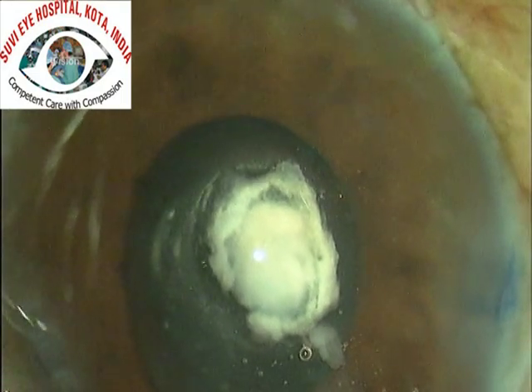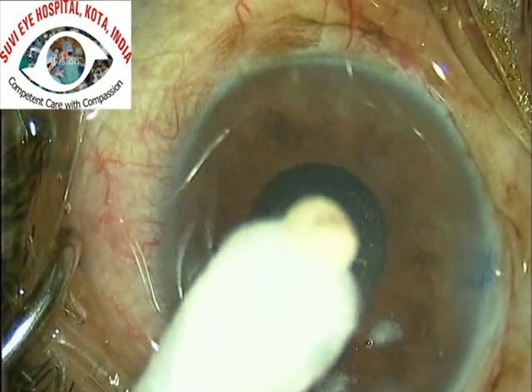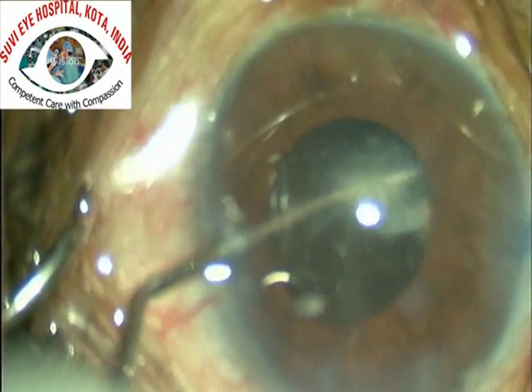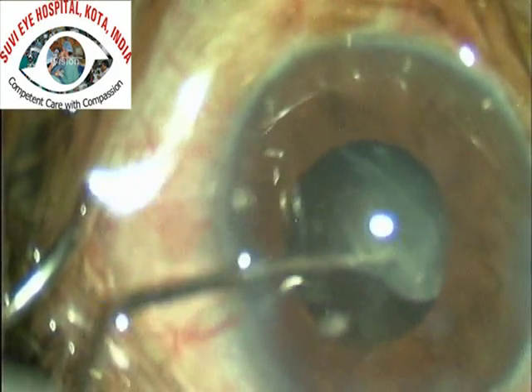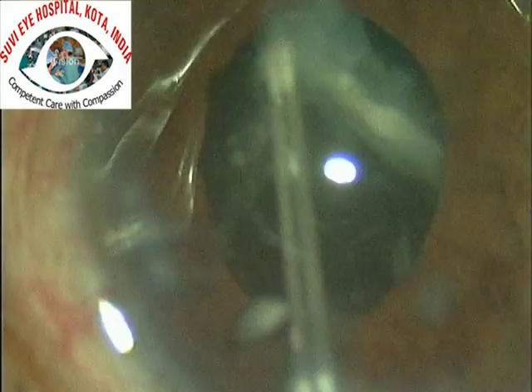The plaque sometimes comes off with good visco-dissection and irrigation aspiration, but it may actually need technically skillful plaque peeling, or sometimes we may even have to do a posterior capsular rhexis. This is another plaque being removed from another case.